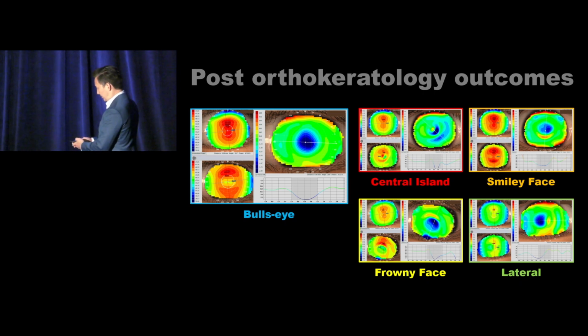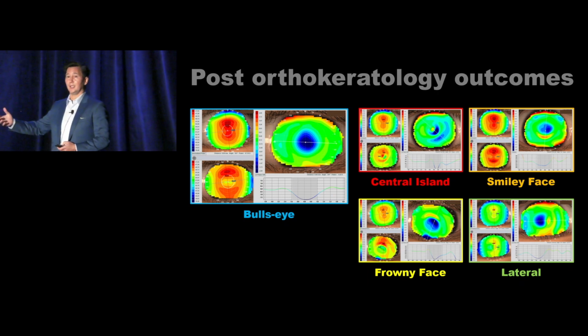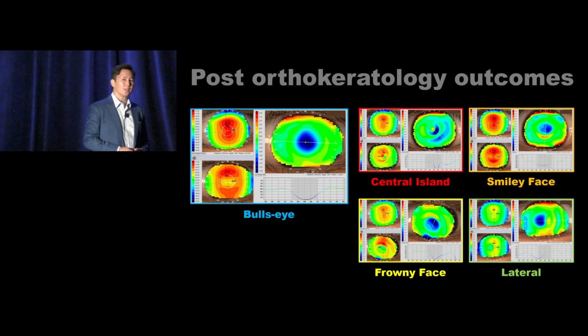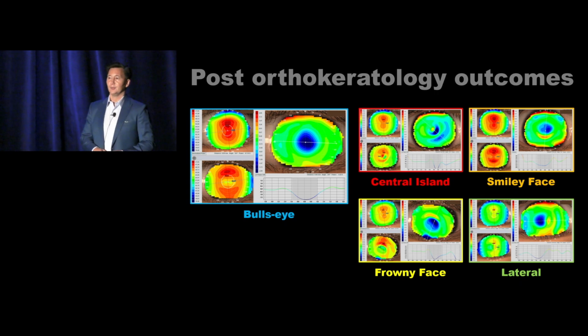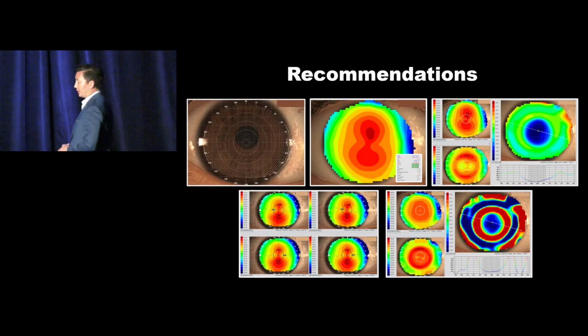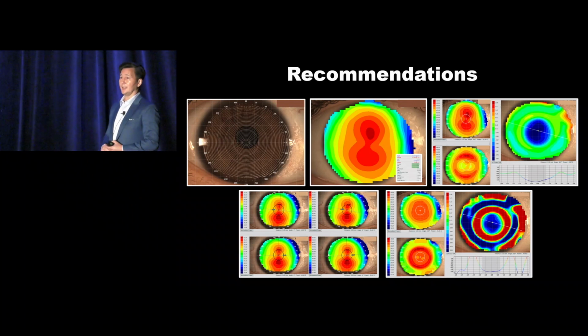Make sure they've got baseline map, post-wear map, so they can do a subtraction, or you're sending them a PDF of this entire image. So you've got the full subtractive. Don't send just the post-treatment by itself because that won't give the consultant the full picture.